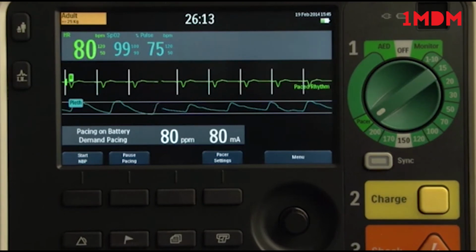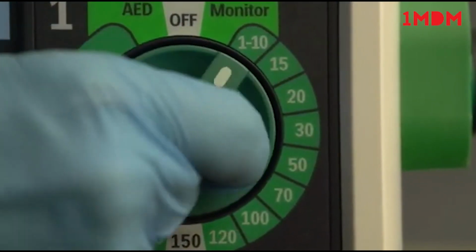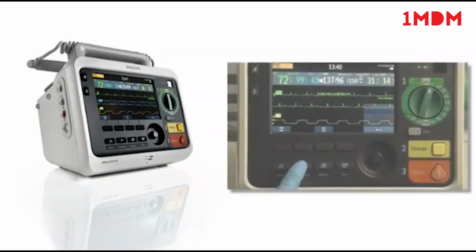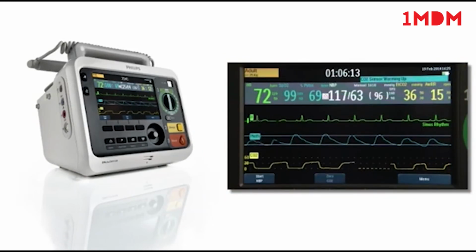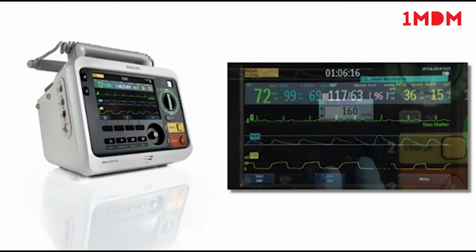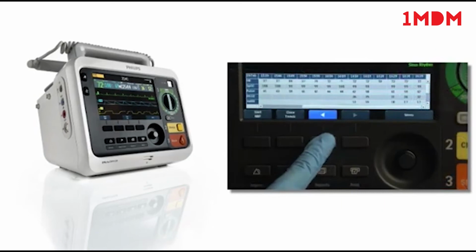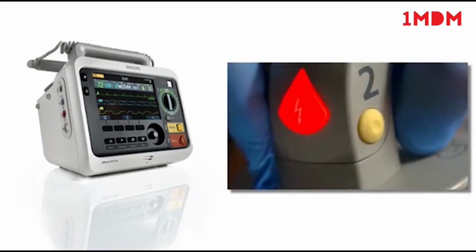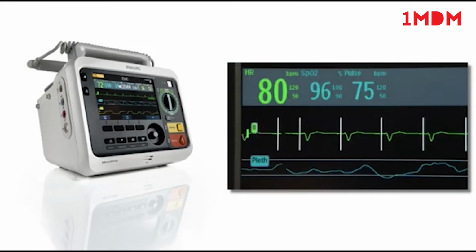When pacing is no longer needed, turn the therapy knob from pacer to monitor. This completes our program on the Efficia DFM100. We've covered an overview of the device's features and controls, explained how to monitor ECG, SpO2, NBP, and EtCO2, manage alarms, and display trending data, and demonstrated AED and manual defibrillation, sync cardioversion, and pacing therapy.